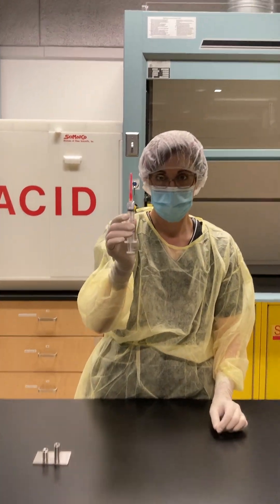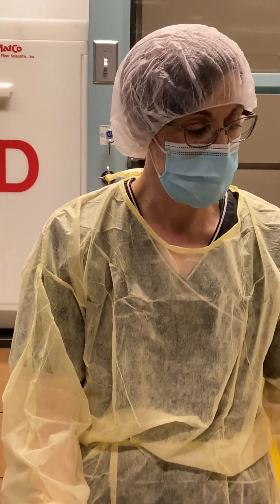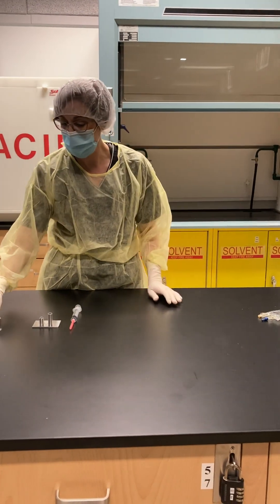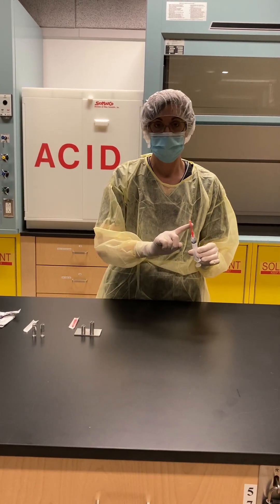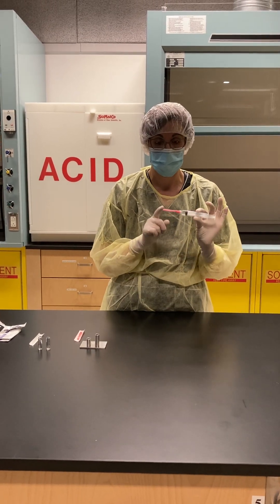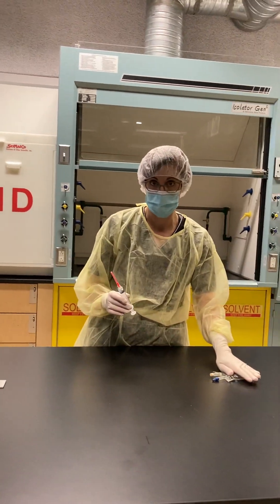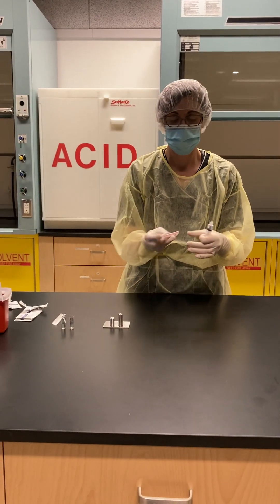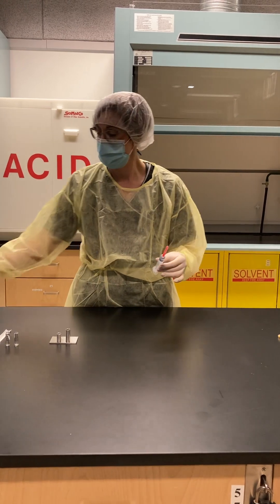You can see we're at two mils now. Before I inject into my sodium chloride 0.9% 50 ml bag, I'm going to take another new needle. The reason for this is that when I was pushing the fluid back into the ampoule, there's potential that glass and debris got onto my needle, and we do not want that to end up in our final compounded sterile product.